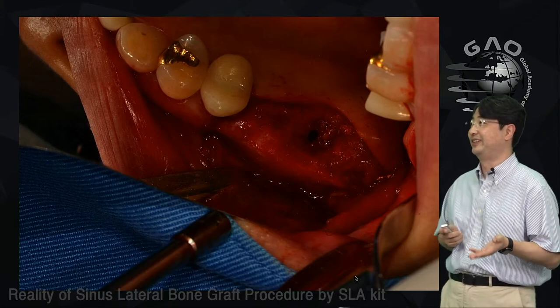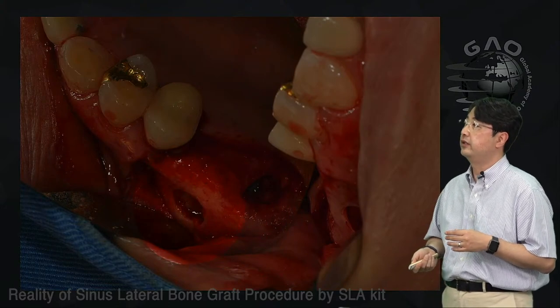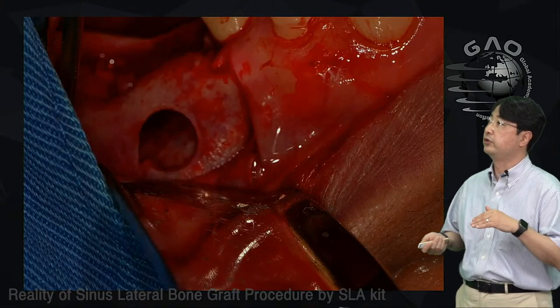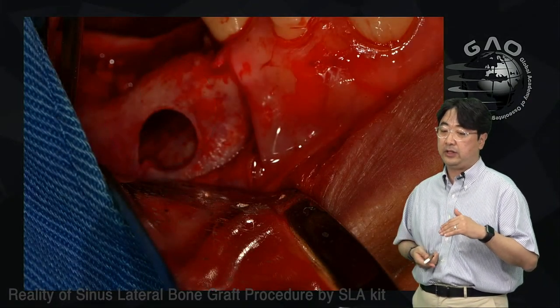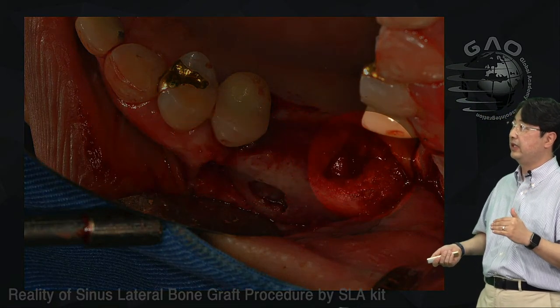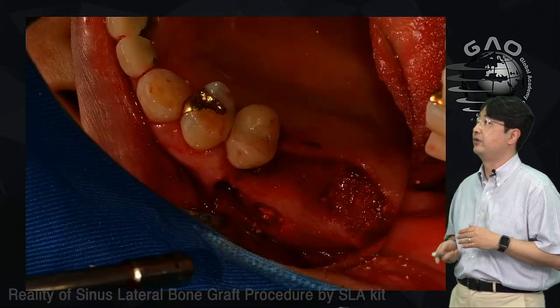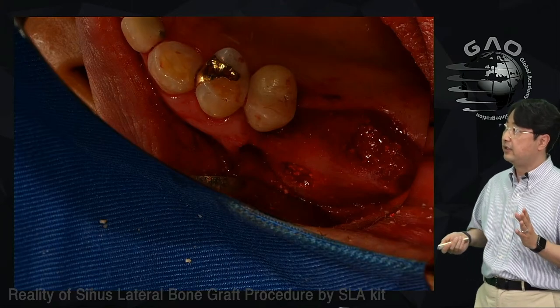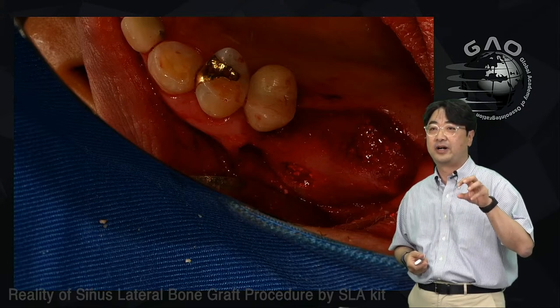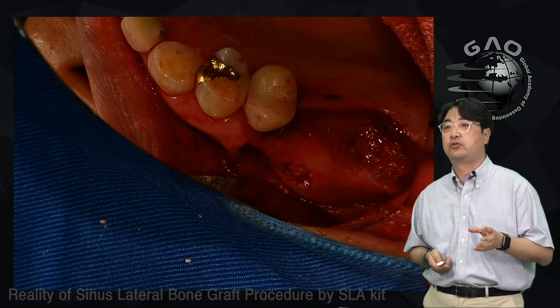So now what are you going to do? What I did was I made a window on the area of number 26, and then I dissected the membrane, including the tearing part, right? I placed the collagen tape through the crestal opening on the number 27 area to cover the tearing part. Then I did the bone graft, not from the lateral window. I did the bone graft through the crestal part.